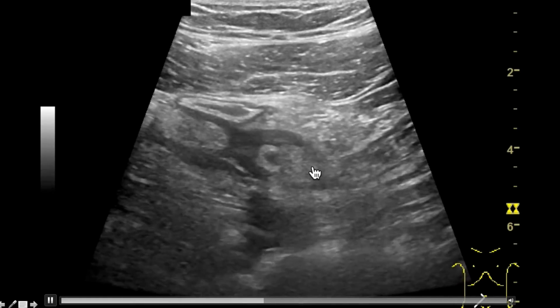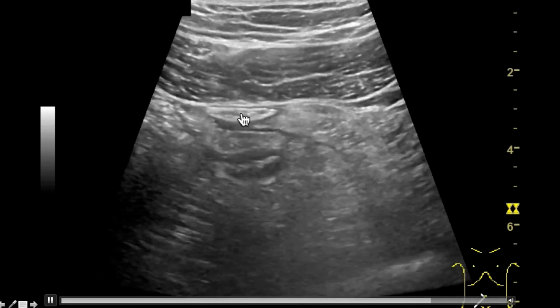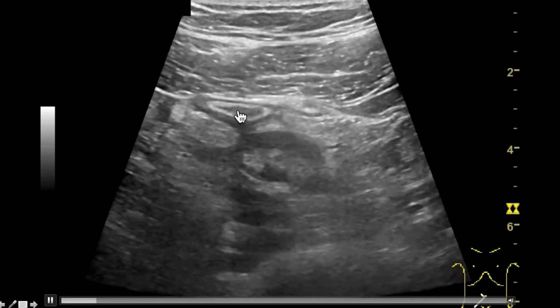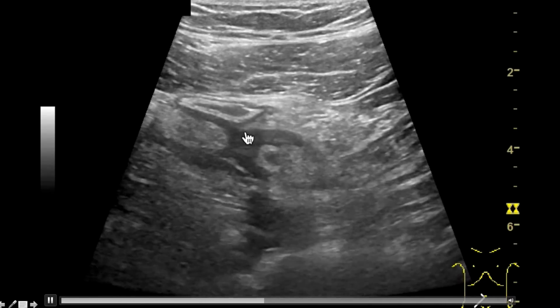It is rigid and shows no peristalsis whatsoever. The surrounding pronounced reticular reaction. And here again, for a comparison, the terminal ileum. Here the terminal ileum. Similar course, also a little wall thickening here due to the inflammation.